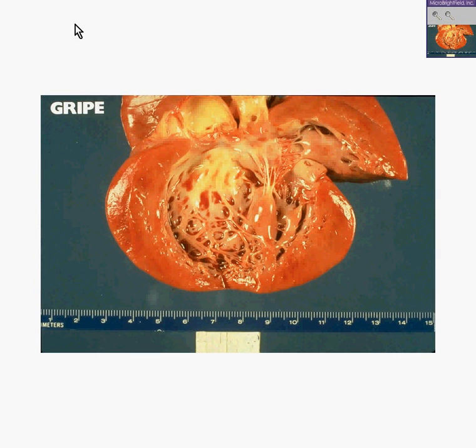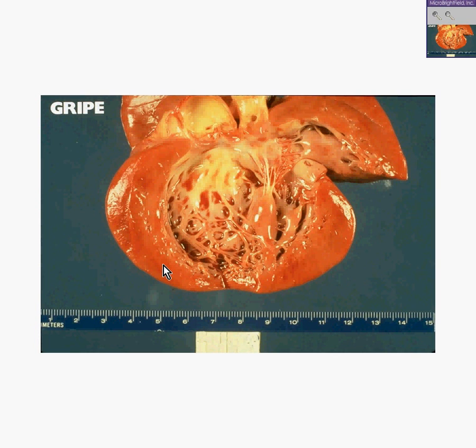Here is a case of glycogen storage disease. From its name, you would think that glycogen storage disease means glycogen is being stored — and that's right, because that's what it is. In this case, it's being stored in the heart. You can't really tell it's glycogen though; it just looks like a thick wall, which you might think is due to hypertension or fiber hypertrophy. But it's really thick because the muscle cells are accumulating glycogen within them, as an enzyme is missing to deal with that glycogen.